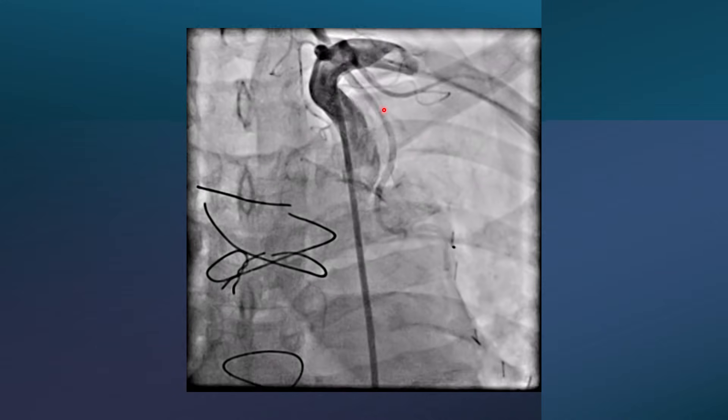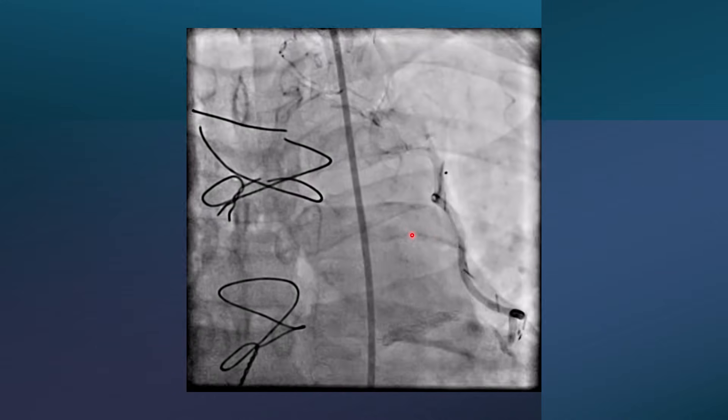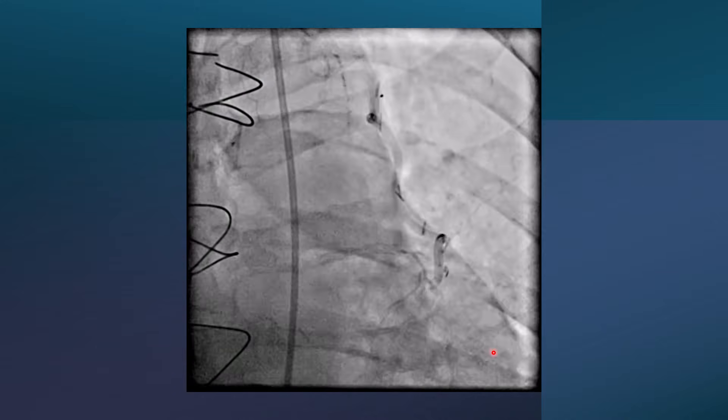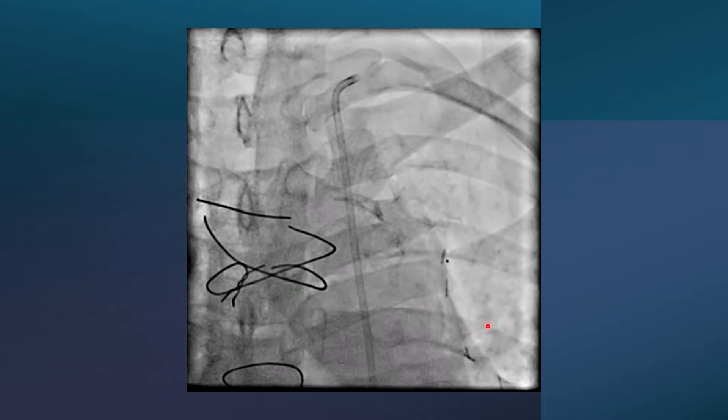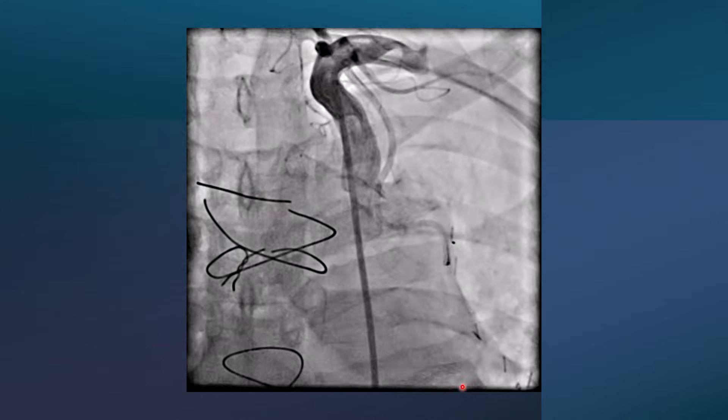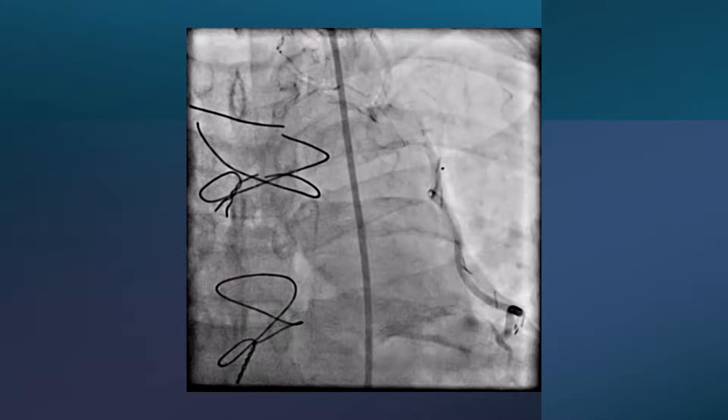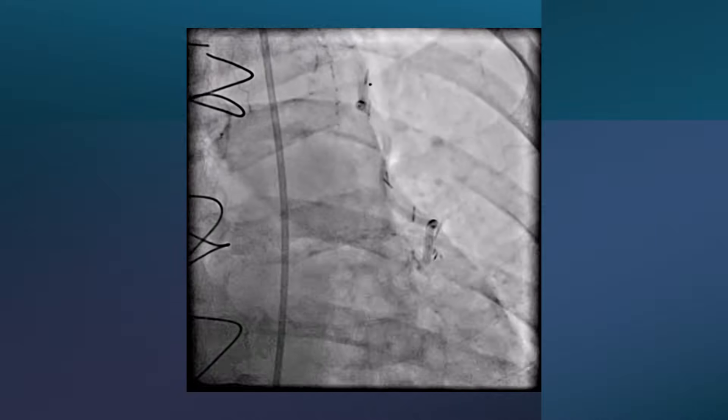This is the LIMA to LAD. It is patent and the LAD is okay. There are some lesions in the distal LAD but none are critical.